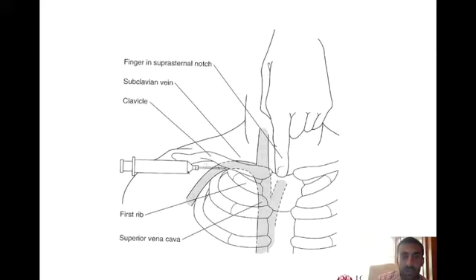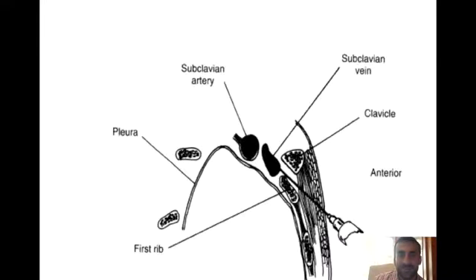And so whether this occurs in this fashion or this fashion is one of the key differences, and makes the lateral approach to the subclavian vein very challenging without ultrasound, because you literally have a large area where you would not be able to know without any relative anatomy that could show consistency. So that's why historically we've really targeted this area. But again, I'd like to highlight the fact that ultrasound can help identify this pathway and provide a new avenue of where we potentially could place our subclavian vein catheters.